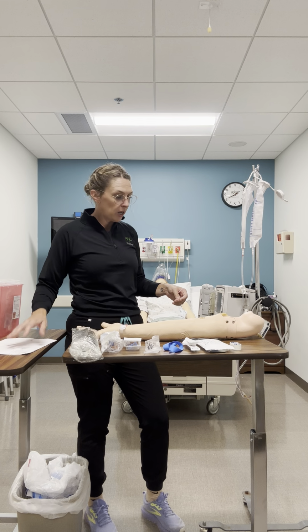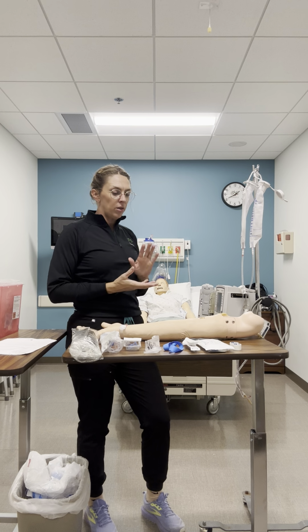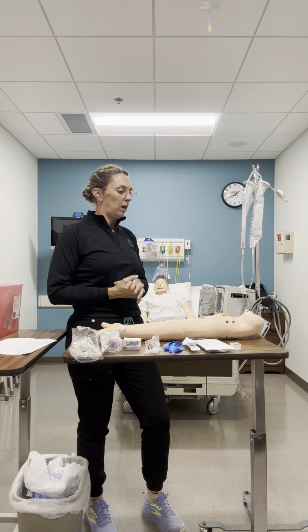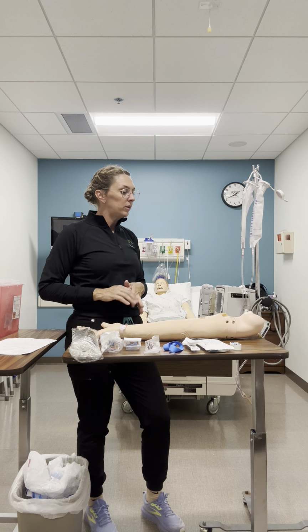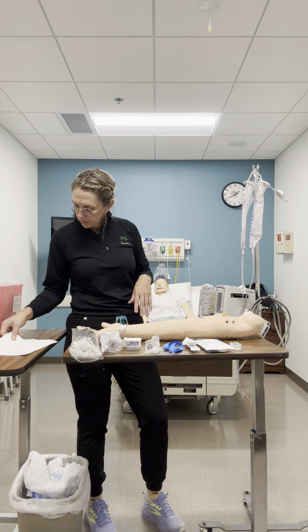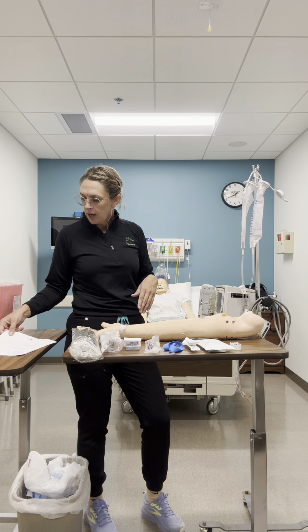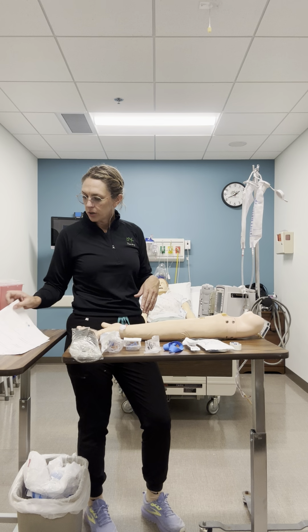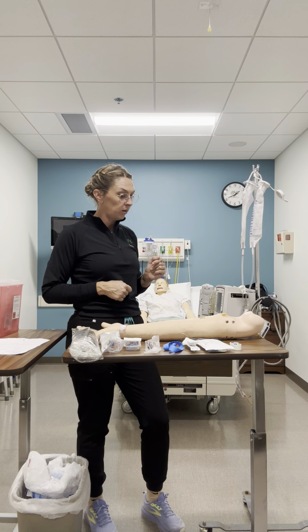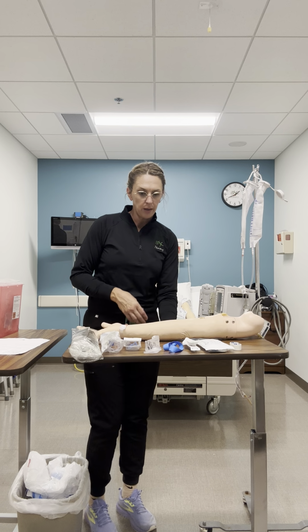So today I am here to start an IV. The doctor has ordered an IV because you are slightly dehydrated. Stress fluids. We're going to have you on this IV until it's been ordered to be discontinued, and it's just some extra fluids, so support for you. Do you have any questions? No? Okay.